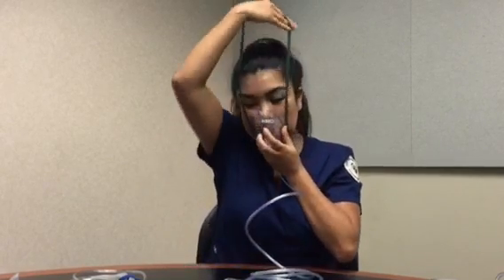And the way that you're going to be placing the simple mask is over the patient's nose and mouth, which I will demonstrate in a bit. I just want to make sure that you see that there's a little bit of wire right here, and you're going to go ahead and pinch it on top of the patient's nose. That way you can make sure that it's a snug, secure fit onto the patient, okay? And so this is the way that it's going to be placed. Just like this. Just pinch it here at the bridge of the nose. And make sure that it's a snug, secure fit for the patient.